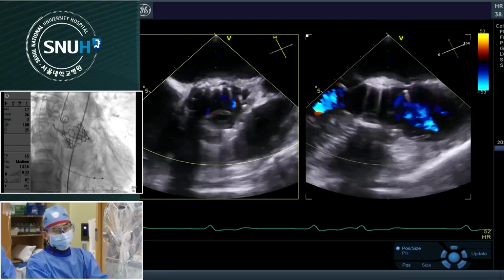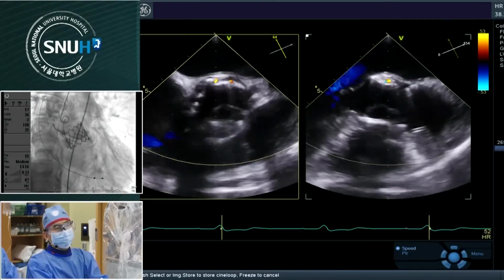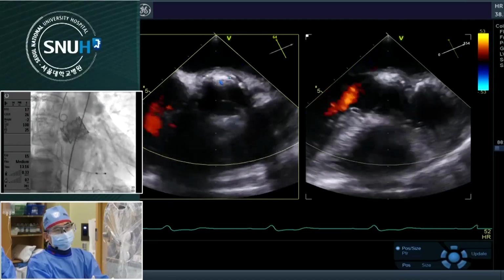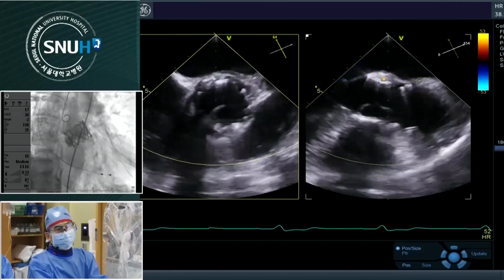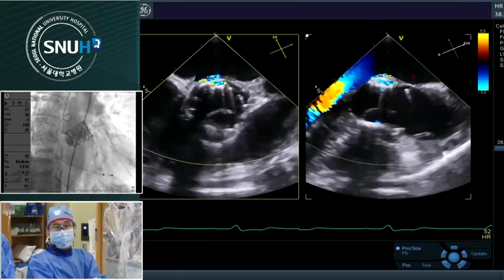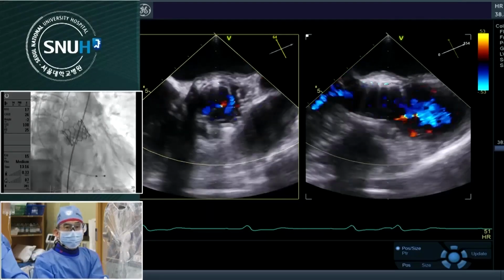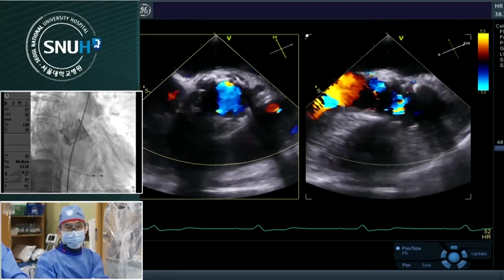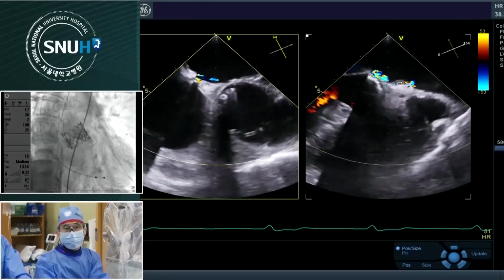Yeah, mild to moderate degree leakage should be corrected on site, but minimal leakage has high probability to regress during OPD follow-up in our experience. Thus, I don't do anything further. But the interesting message is that even a subtle calcium unequal distribution on the non and left coronary cusp may induce such minimal leakage. We expect the perfect results because calcium amount is not so much, and we chose a bigger valve, oversizing this 15 or 17%. That valve has an outskirt to prevent leakage. But we cannot abolish the leakage because of subtle, interesting distribution of eccentric calcification.